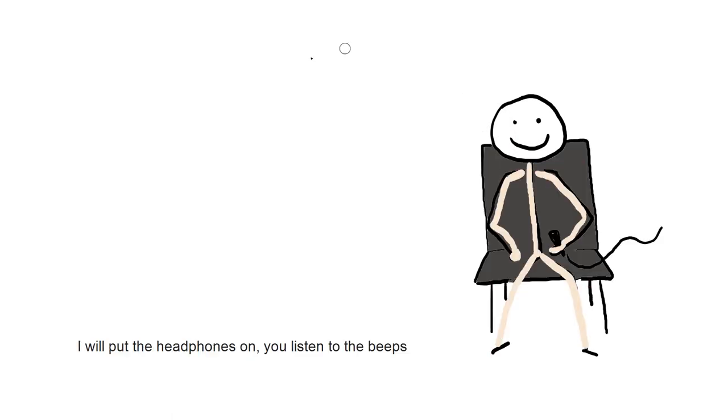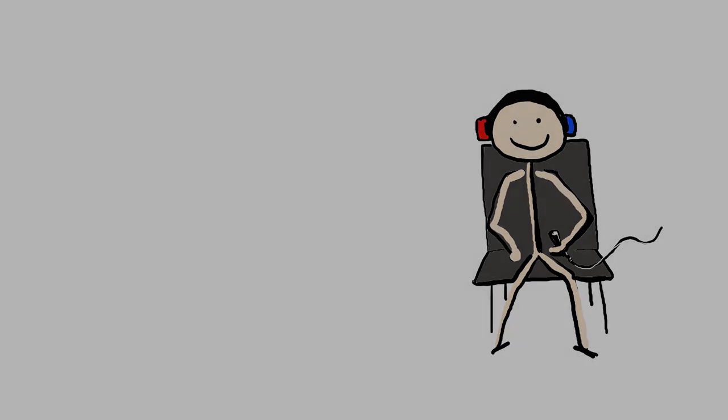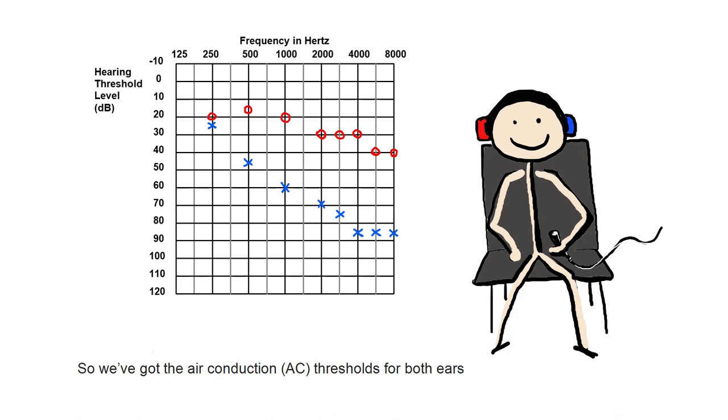Please take a seat. I'll put the headphones on. You listen to the beeps, and here's the responder. You know what to do. So we have got the air conduction thresholds for both ears.